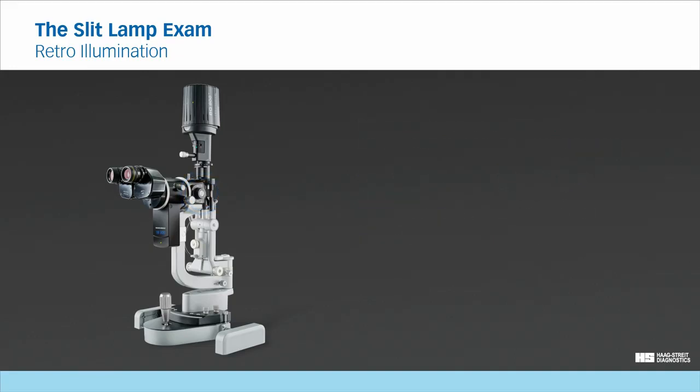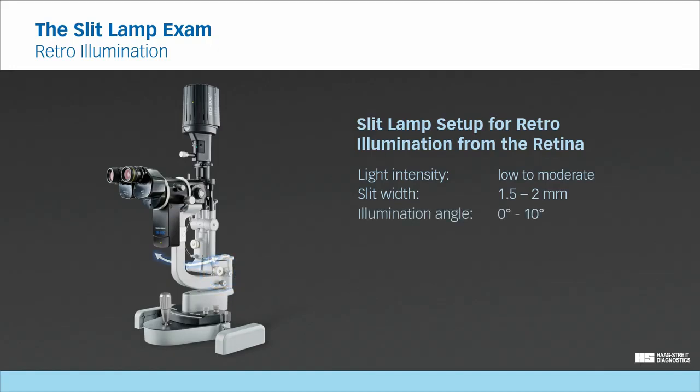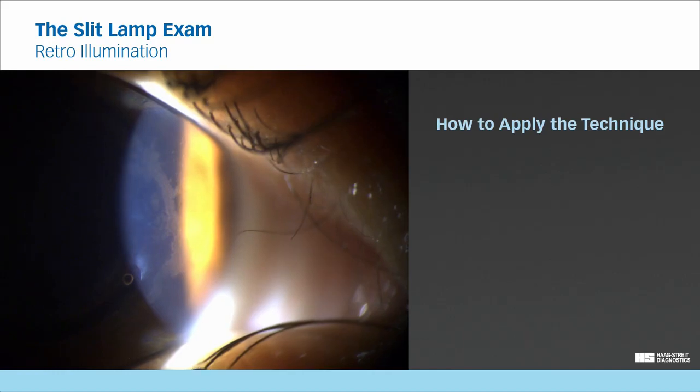When the retina is used for retroillumination, choose a low to moderate light intensity and a slit width of about 2 mm. Set the illumination angle between 0 and 10 degrees. Choose a magnification of 10 times and zoom in if required. How to apply the technique.